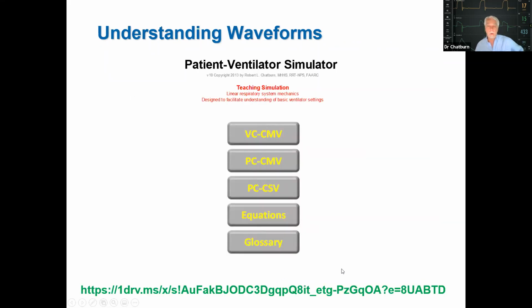Now, before we go any further, I want to show you a little tool that you have access to. I imagine that you will have access to these slides or to the videotape. If you use this link on this website, you will be able to download a patient ventilator simulator that I designed. It runs on any computer that has Excel. And you can see that it allows you to simulate volume control ventilation, pressure control ventilation with mandatory breaths, and pressure support. And there's some other information associated with it, equations and a glossary and things like that.